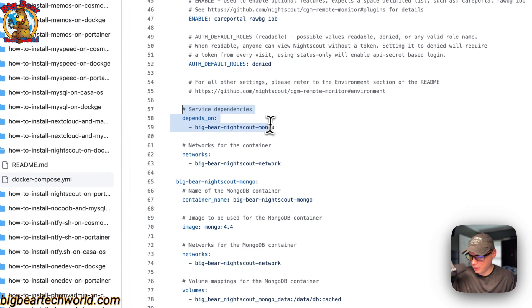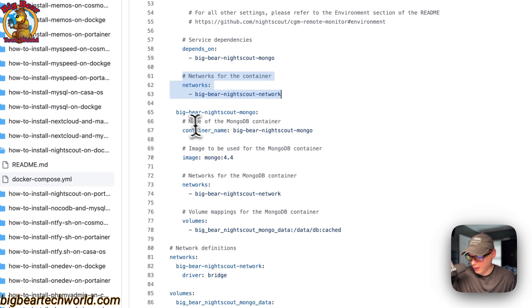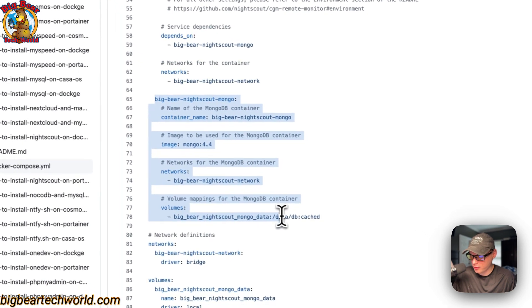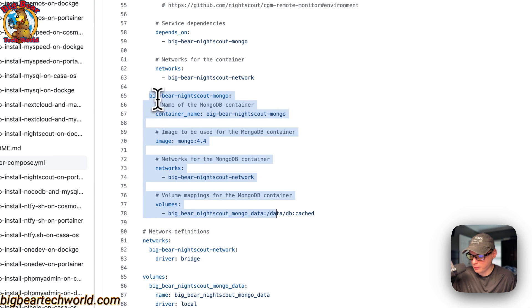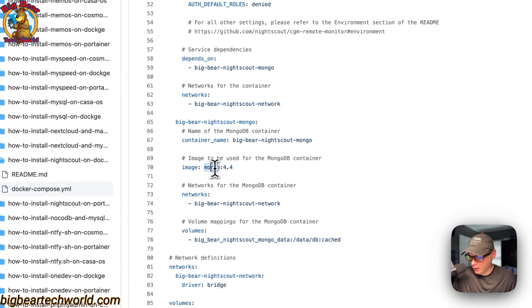This Nightscout service depends on the MongoDB service 'big-bear-nightscout-mongo.' The network for this container is 'big-bear-nightscout-network.' The next service underneath services is 'big-bear-nightscout-mongo,' with a container name of 'big-bear-nightscout-mongo' — this is so Docker doesn't generate a random name. The image is 'mongo,' coming off Docker by default, with its own Docker image tag.